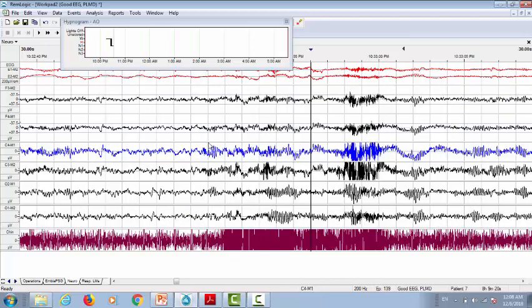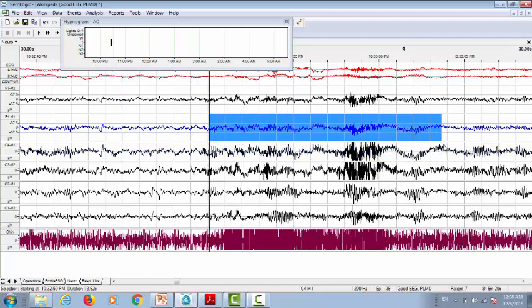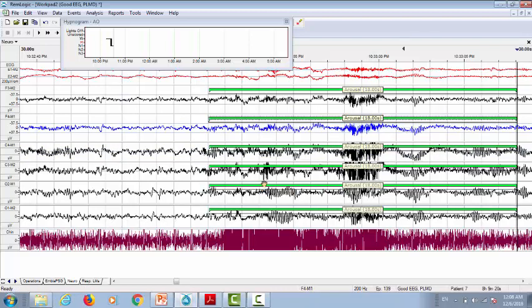We have a significant increase in the EEG frequency, or an abrupt shift in the EEG frequency, which makes more than 3 seconds. The majority of the epoch is comprised by alpha as a result of the arousal, and this epoch should be scored as wakefulness.